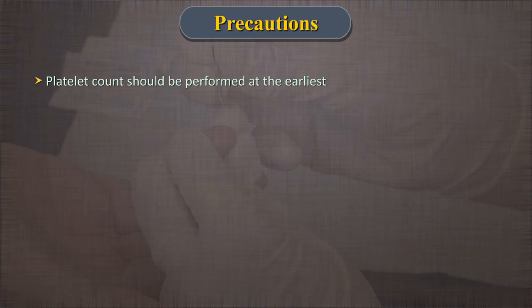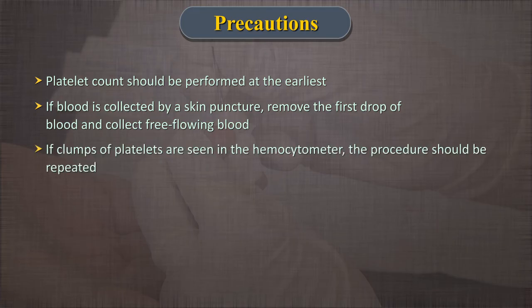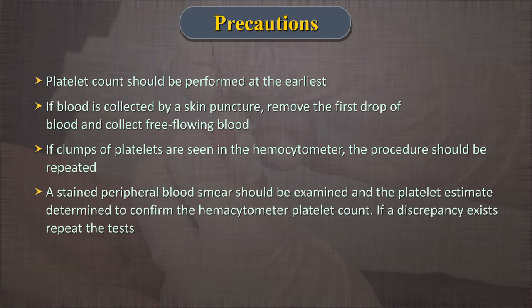Things to take care of to avoid error: 1. Platelet counts should be performed at the earliest. 2. If blood is collected by skin puncture, carefully remove the first drop of blood and collect the free-flowing blood for the platelet count — this will minimize platelet clumping and adhesion of platelets to the puncture site. 3. If clumps of platelets are seen in the hemocytometer, the procedure should be repeated. Clumps may be due to inadequate mixing of blood or poor technique in obtaining the specimen. 4. A stained peripheral blood smear should be examined and the platelet estimate determined to confirm the hemocytometer platelet count. The platelet estimate should correlate with the platelet count.